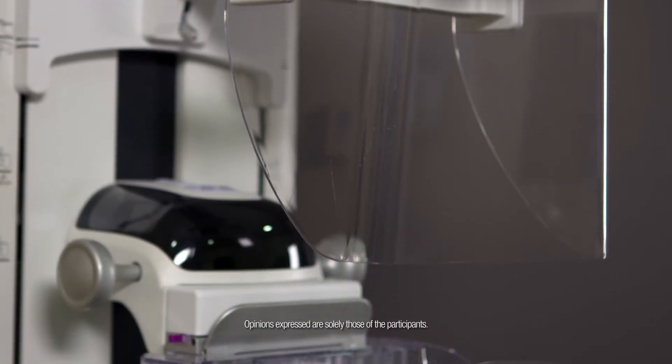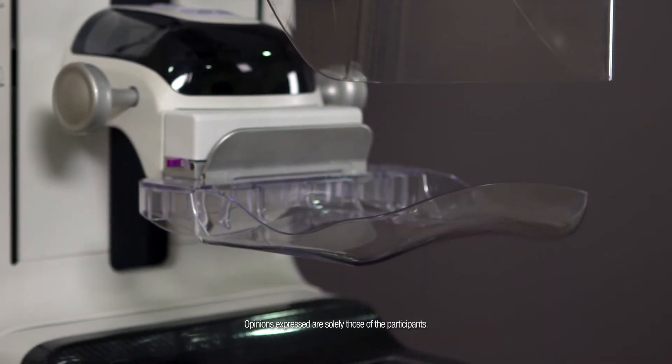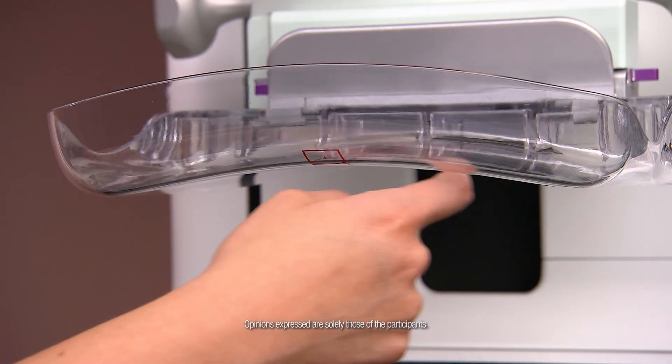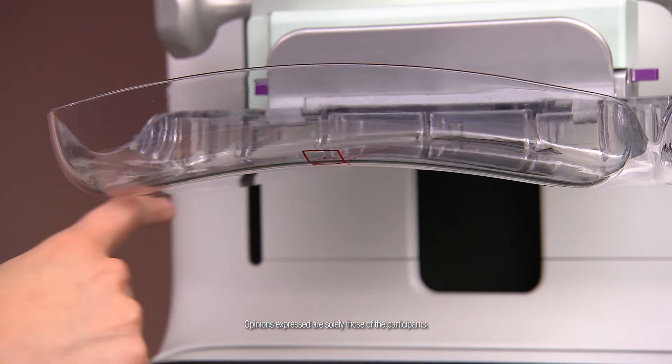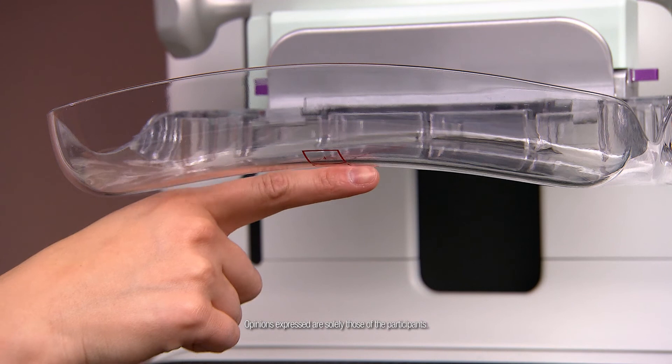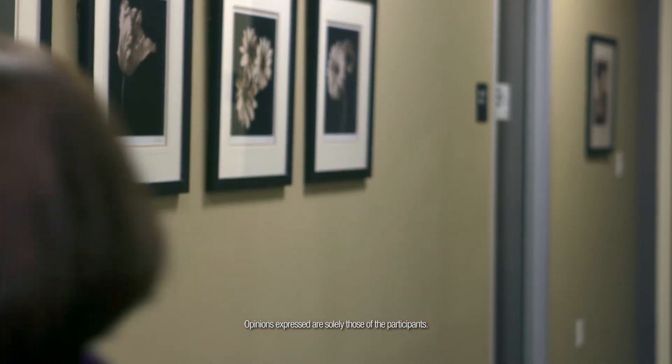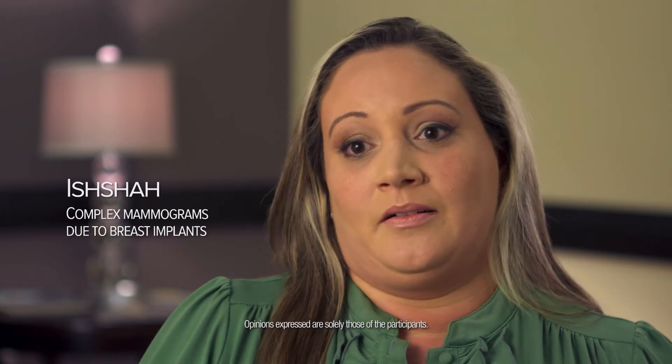Any tool that we have that can help with the compression I think would put the women at ease. If we can explain ahead of time that we have a new device that's going to help with compression and will be more comfortable for you, I think that will have the patient relax and we can get a better quality study. I'm very excited about the SmartCurve system because the patients' comfort is very important to us — not just diagnosing them, but knowing that they're going to come back. I would definitely recommend facilities that have the curve compression; it was a great experience for me.